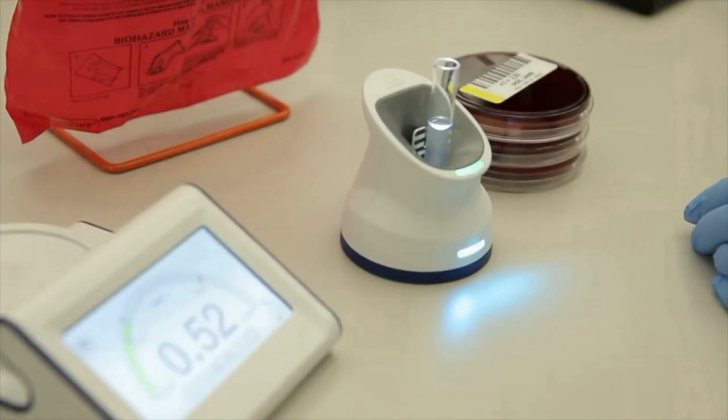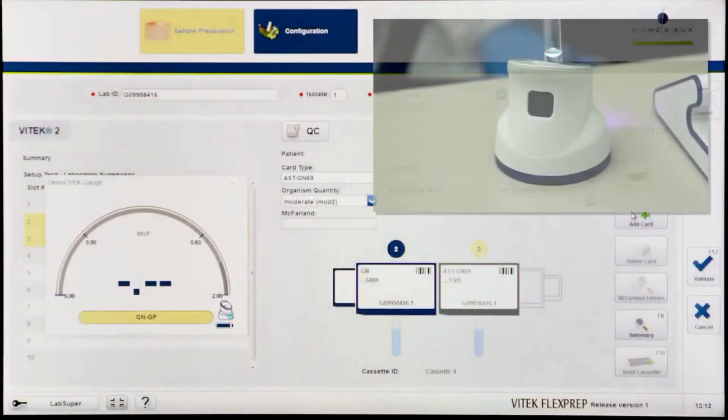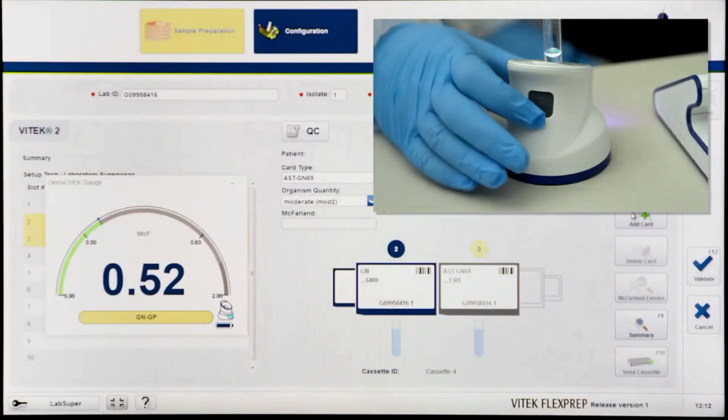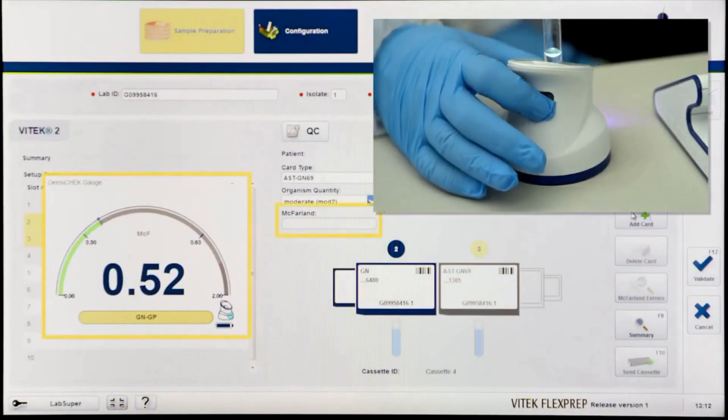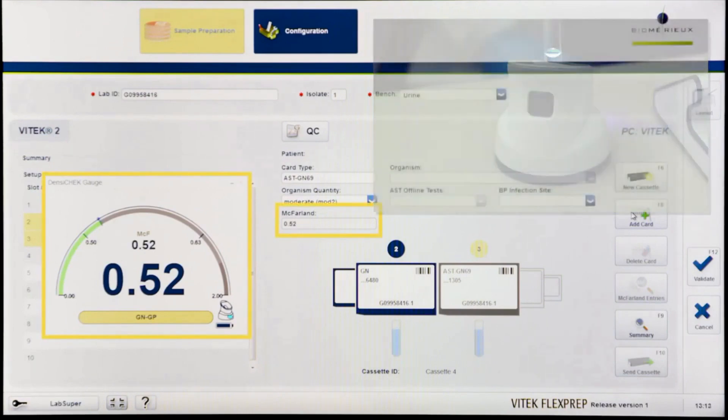The Vitek DensaCheck will indicate if the suspension is of the correct turbidity or requires adjustment. Press the button on the back of the pod to transfer the accepted McFarland value to Vitek FlexPrep.